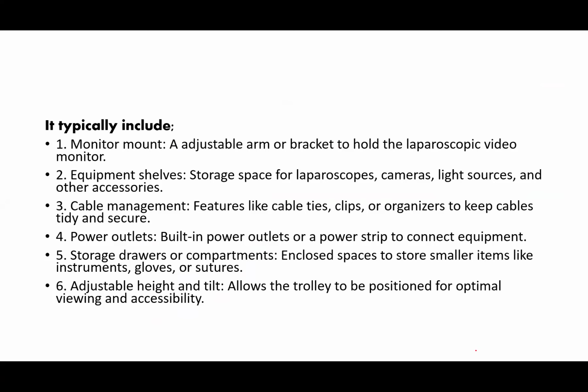Now, equipment shelves are storage space for laparoscope, cameras, light sources, and other accessories. There is a shelf on that trolley where you store all your accessories in such a way that you don't have to be looking for an equipment during a procedure.